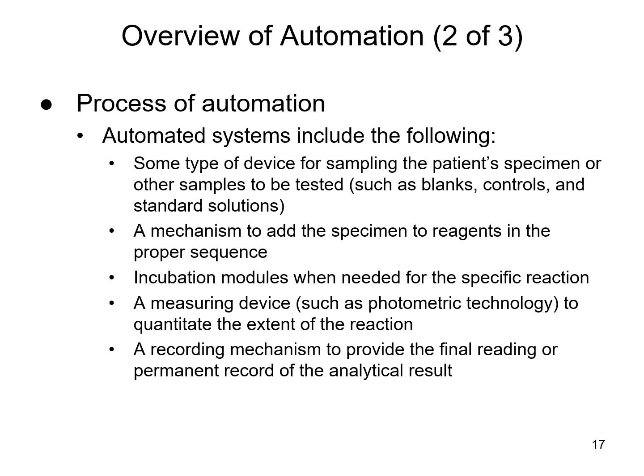Now, as you go more through your courses, you will become more familiar with the whole automation process, but that automation process will include things like some sort of way for that sample to be siphoned up and tested. So there's some sort of pipette or something inside that analyzer.